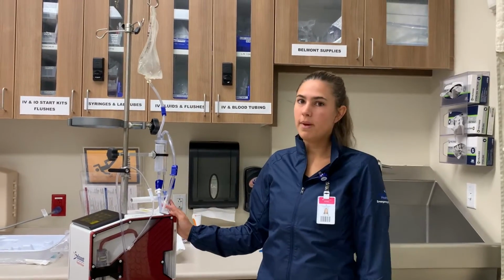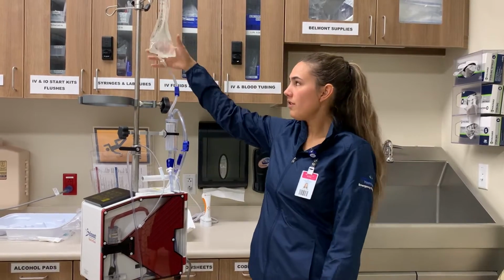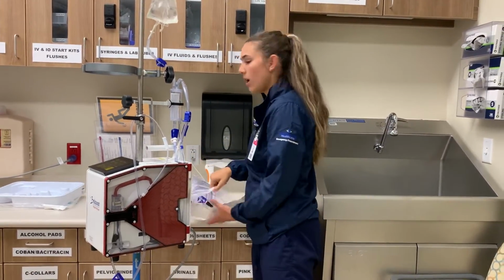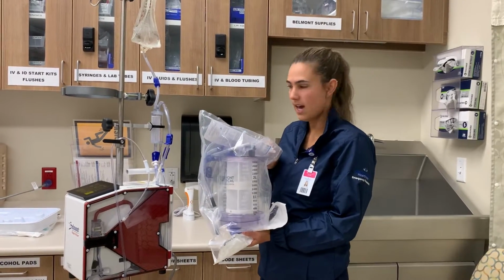If you anticipate needing multiple liters of fluids and multiple bags of blood, rather than constantly switching out the bags, you can use this Belmont 3-liter reservoir that we have. So I'm going to show you how to connect that.